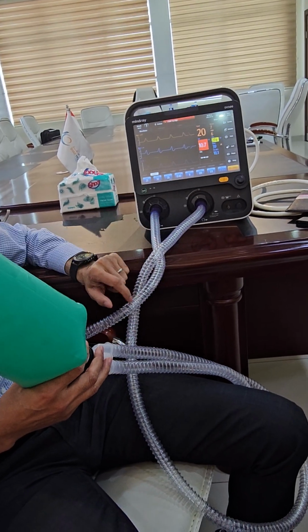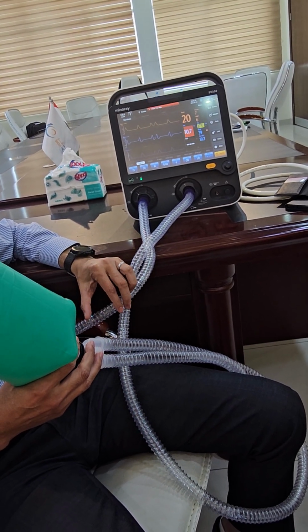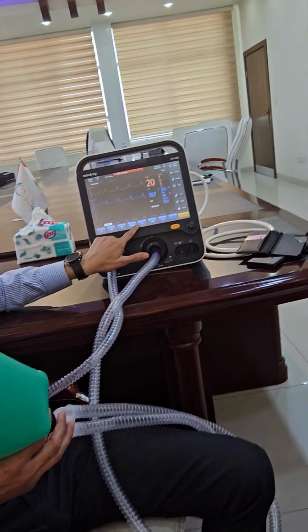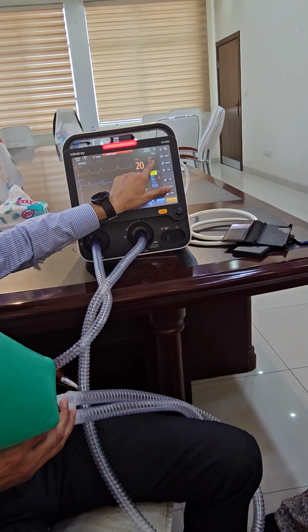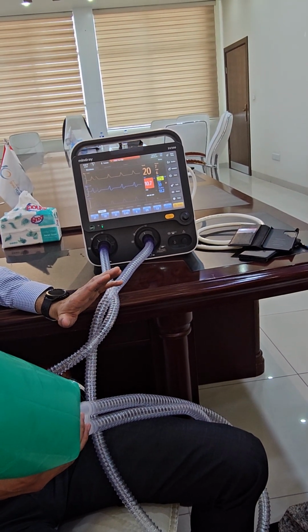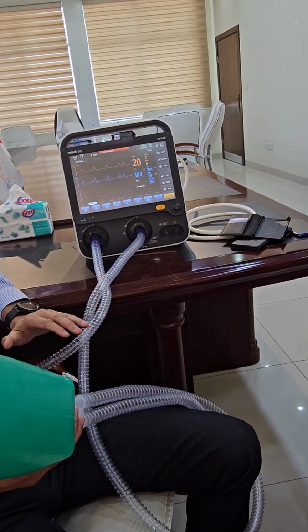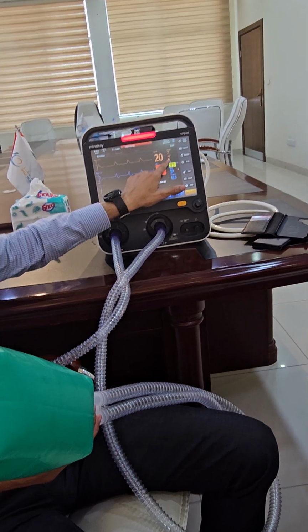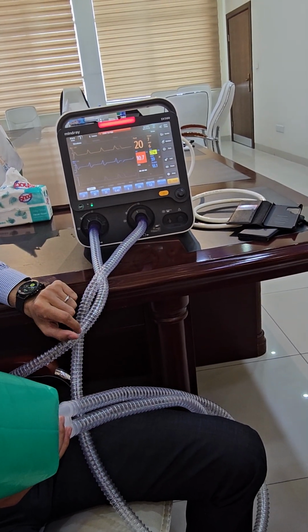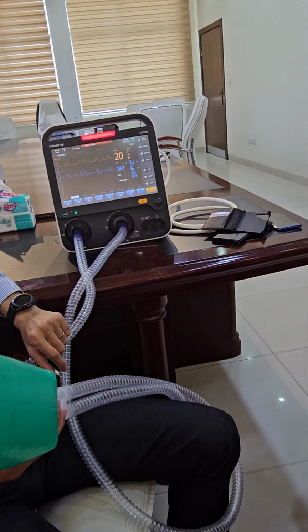Doctor, is 20 too much for PEEP? This is PIP, not PEEP. PEEP is 3 to 4. P mean is the mean airway pressure, MAP, 7 to 10, so this is low. The peak one is 10 to 15. What's the difference between this and PEEP? This is dependent on the patient, and this is independent. You understand now?